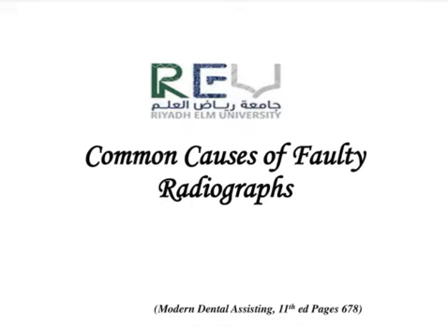So common errors in radiographic exposures can be because of the projection technique or the processing techniques. Okay, projection means when we angulate the X-ray beam with the help of the cone. If the vertical angulation is not correct, we get either foreshortening or elongation.